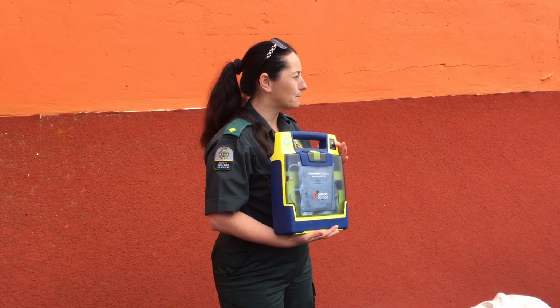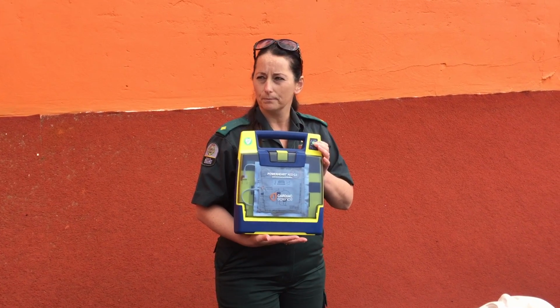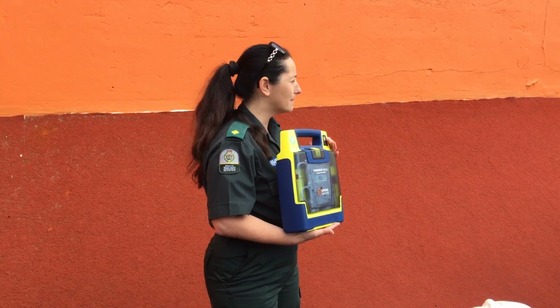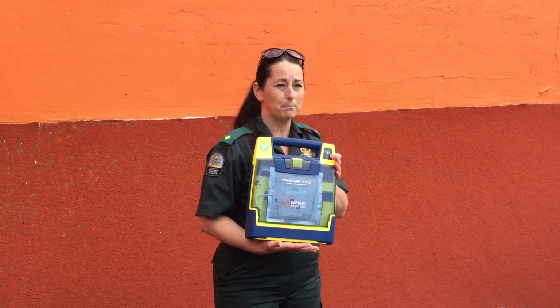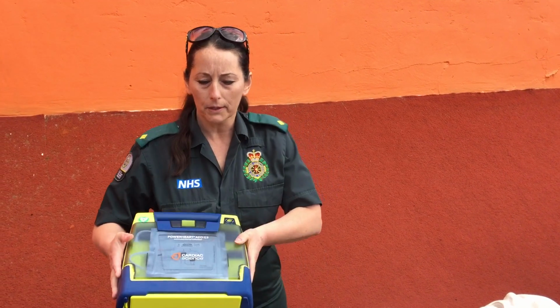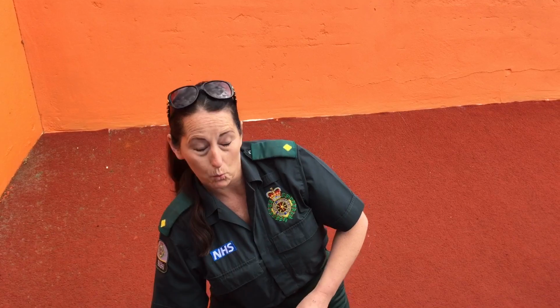And it is ring fenced because it is all about you being able to get to that defibrillator safely and on foot. All right? It's not about you getting in the car, driving 100 miles an hour to get to the defib, which is miles away. It is about being able to get there safely and on foot. So I'm just going to do a quick demonstration of the primary survey with the safe use of the defib. I'll put it all together and you can actually see how it works, and then I'll be happy to answer any questions.